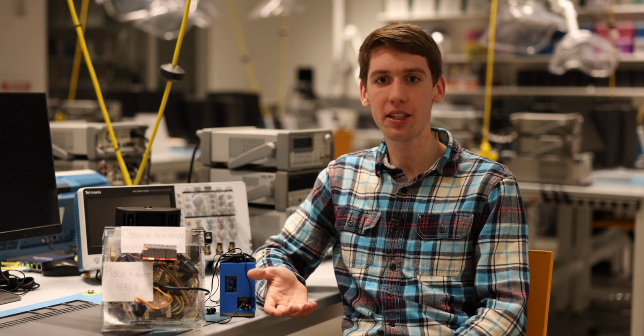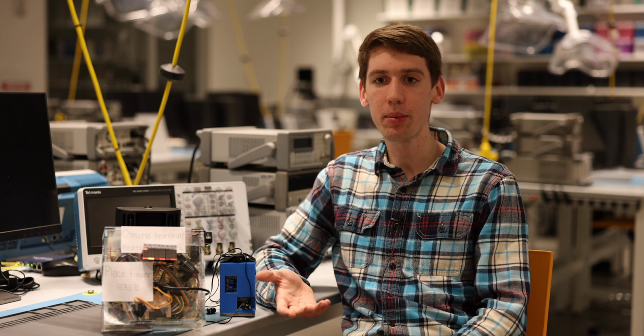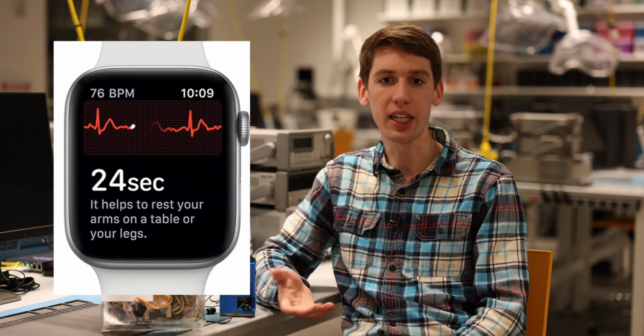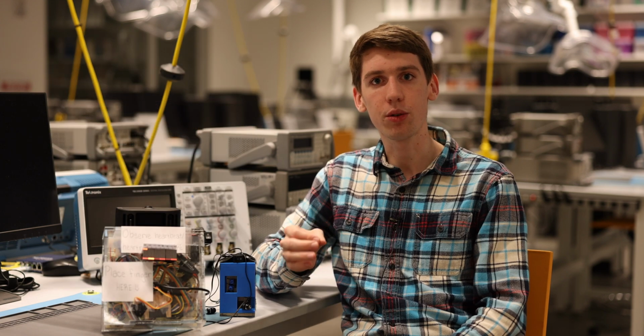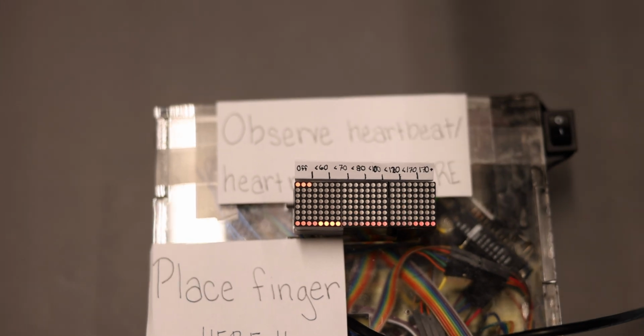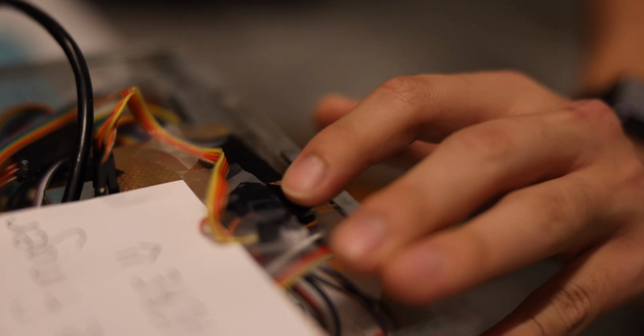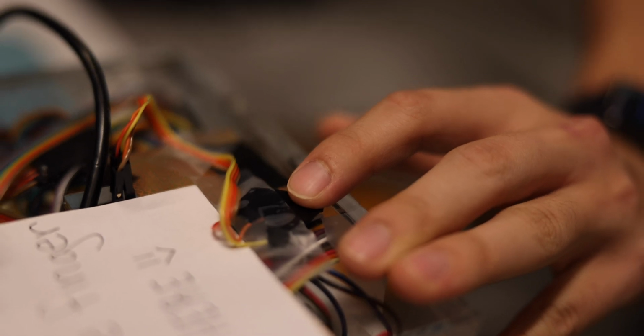Next, we needed a way to display the heart rate. We were inspired by the ECG graphs on Apple Watches, which show a few seconds of history in real time. We chose to use 3 0.8-inch displays, each with 64 dots for a total of 192 LEDs. This posed a difficult challenge since there are not 192 output ports on the Arduino. We needed a way to divide the signal and output a useful image to the screen.